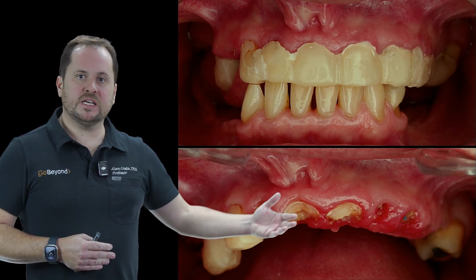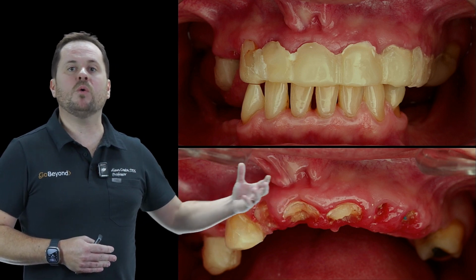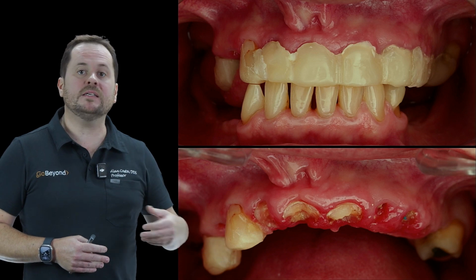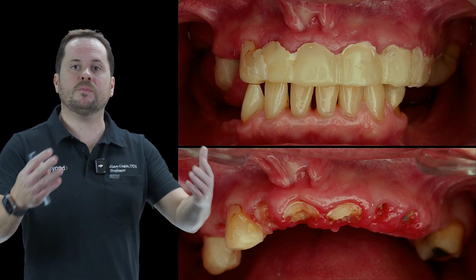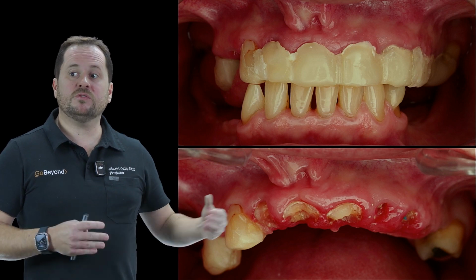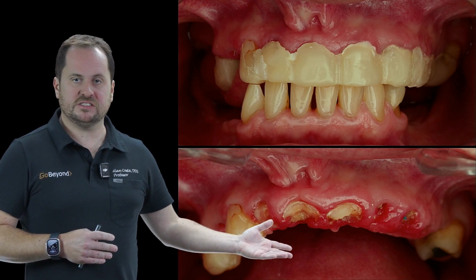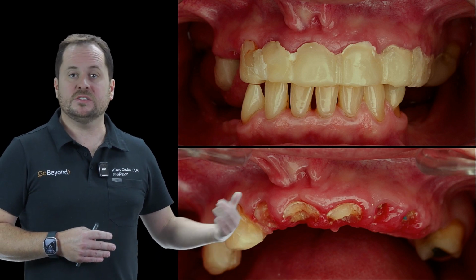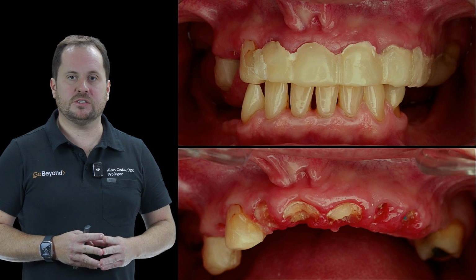A site that is not yet perfectly ready to receive implants requires additional preparation and a conditioning process where you need to work with excellence in soft tissue manipulation, ensuring meticulous handling and careful consideration of every detail. If you suddenly find yourself working in a situation like this, you can often experience considerable aesthetic losses that will be difficult to repair later.